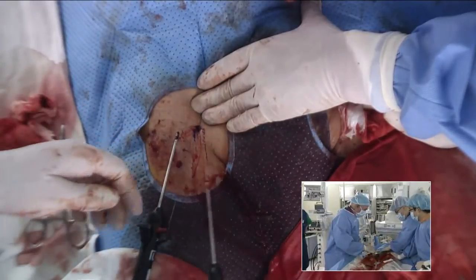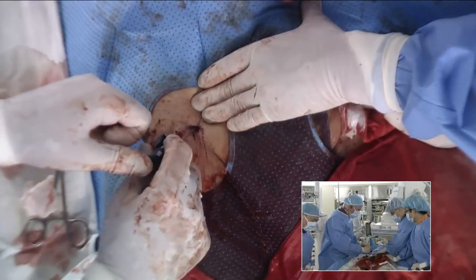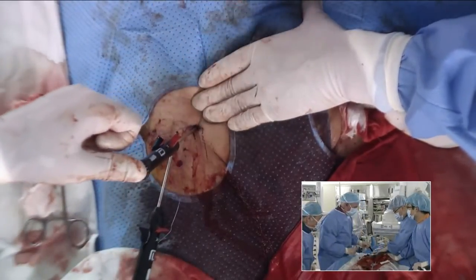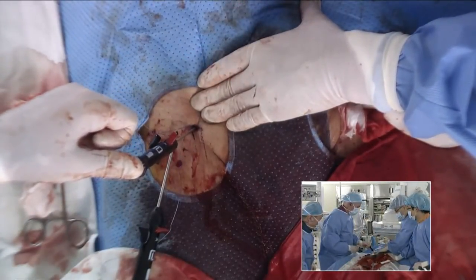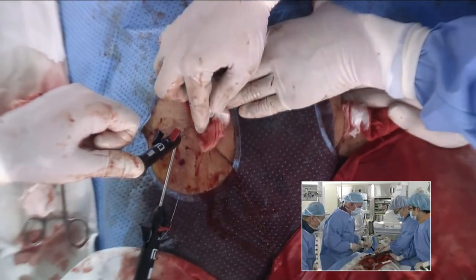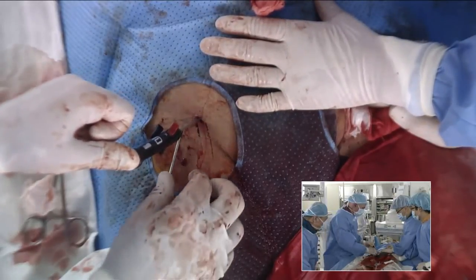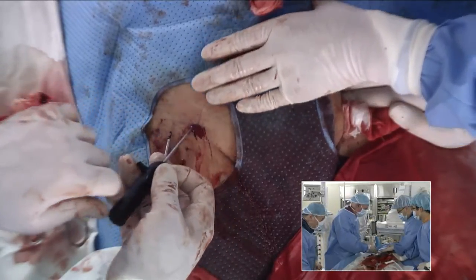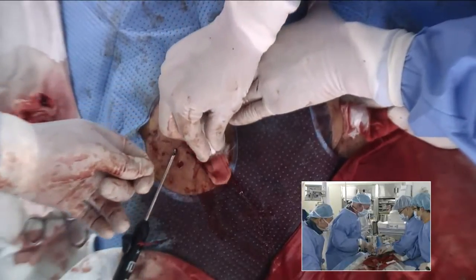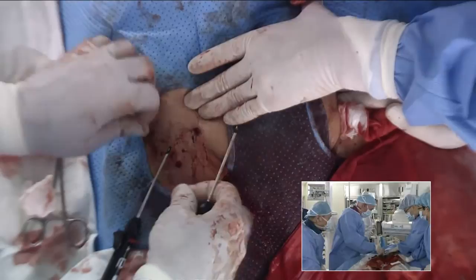Now we're going to go back again with number one. Kind of the joystick technique. Go ahead and let up, Dr. Park. So here we've got a little bit better hemostasis, I think, actually, than with the smaller sheath. So we're going to go ahead and lock this knot, and go ahead and cut that one.